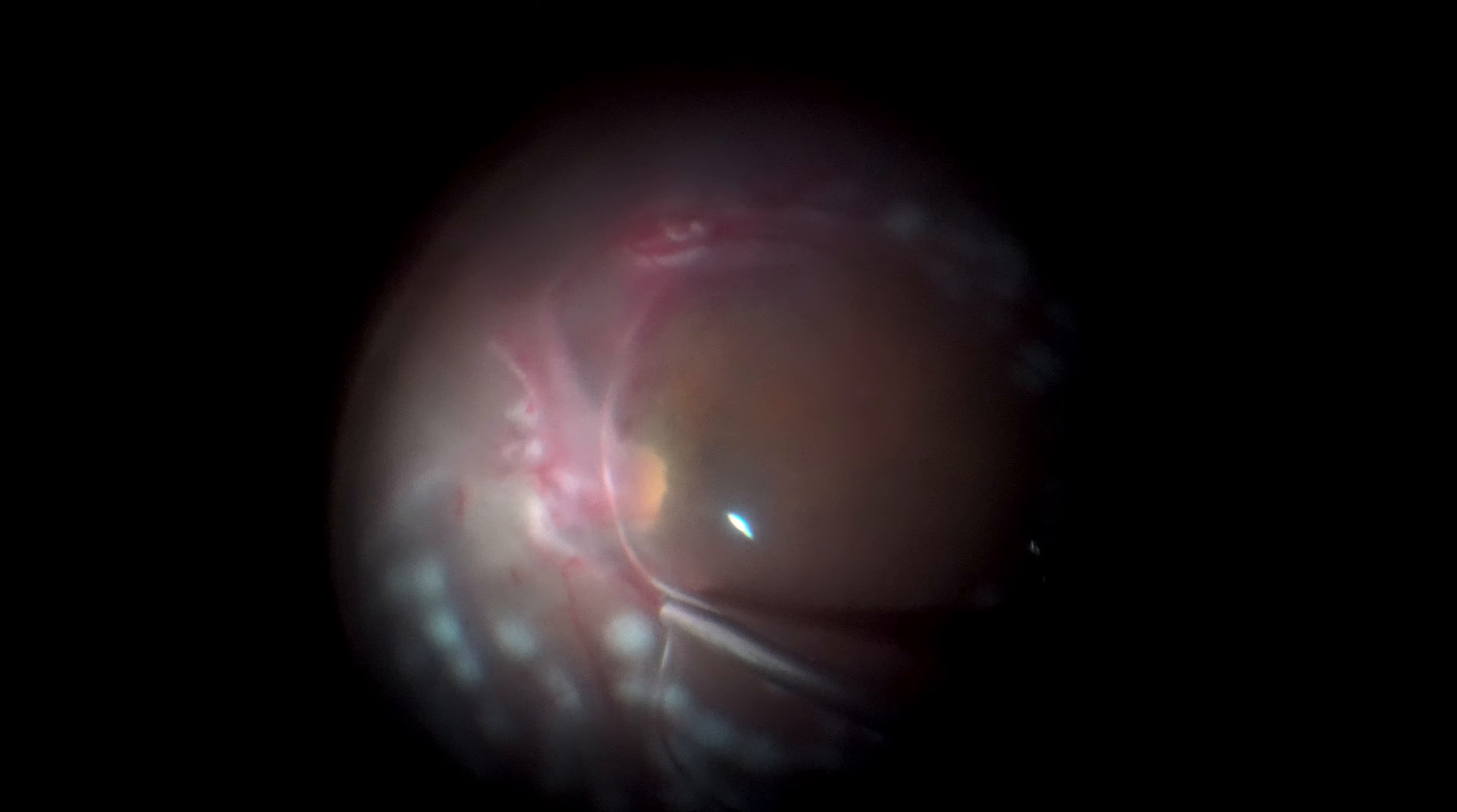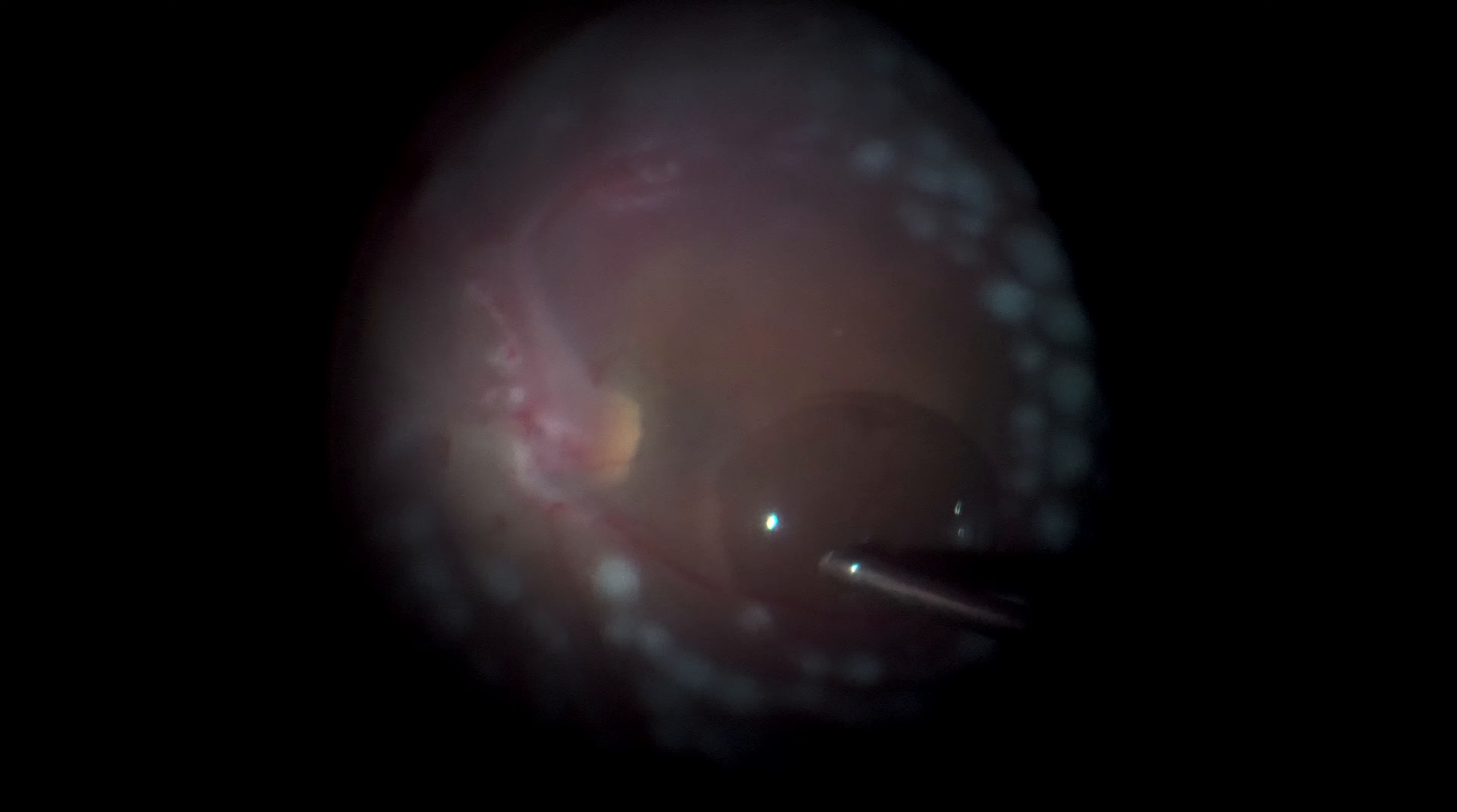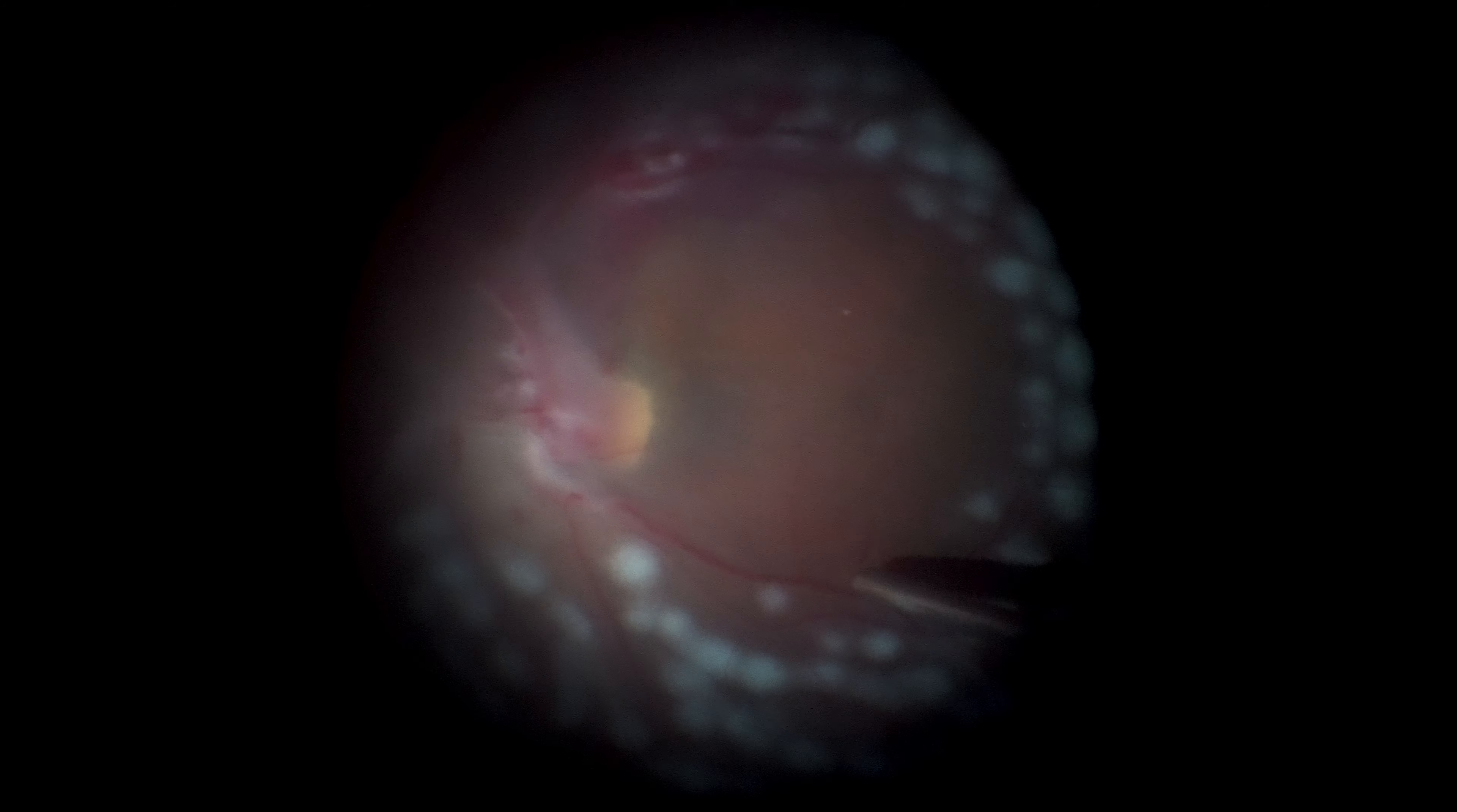It is time now to remove perfluorocarbon liquid together with an air-fluid exchange. The retina remains attached and no more vessels bleed.